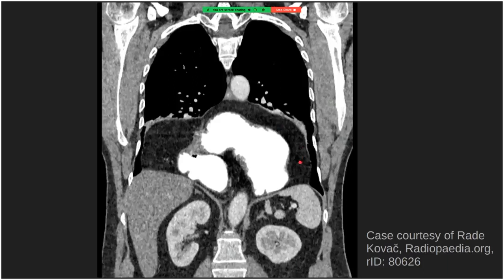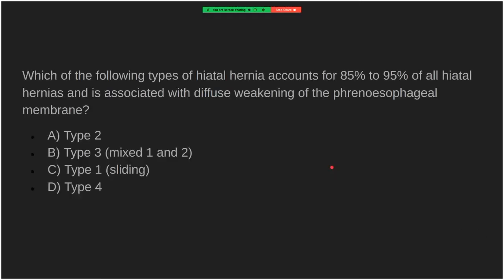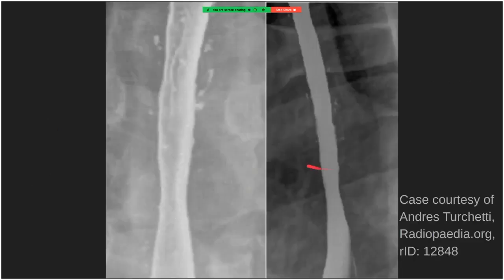Type 3 hiatal hernia is a combination of Type 1 and Type 2. This is a massive Type 4 hiatal hernia, where the stomach is entirely herniated through the diaphragm into the chest cavity. Of the hiatal hernia types, the most common and the one associated with phrenoesophageal membrane weakness is Type 1, the sliding hiatal hernia.